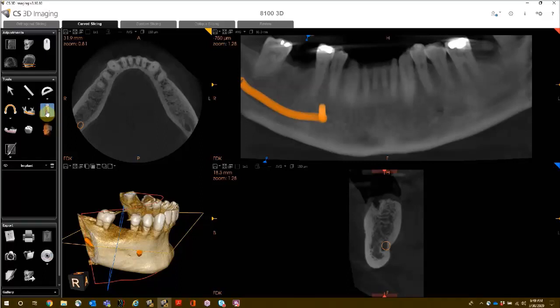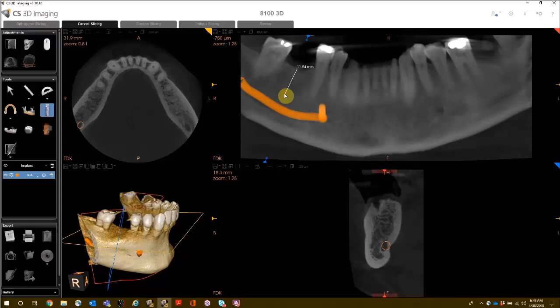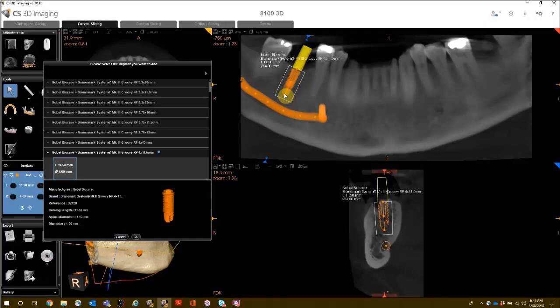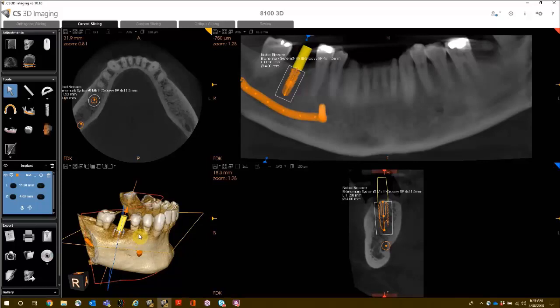There is no need to do a measurement prior to activating the implant placement tool. Once it is activated, single left-click where the implant will start and single left-click where the implant will end. The software will automatically generate a recommended implant — select OK. The implant has three control beads: the beads on the top and bottom move the implant at an angle, and the bead in the center moves the implant from side to side and up and down.